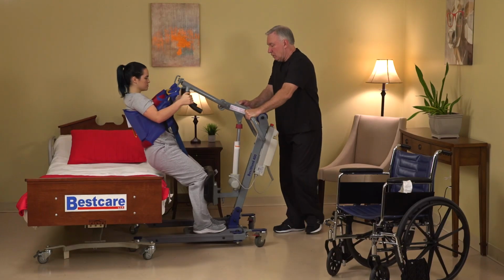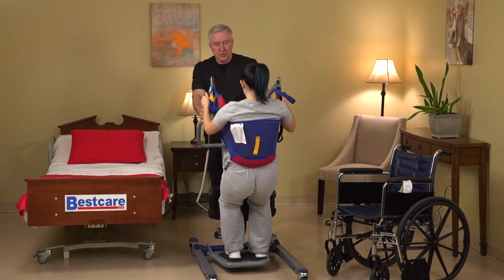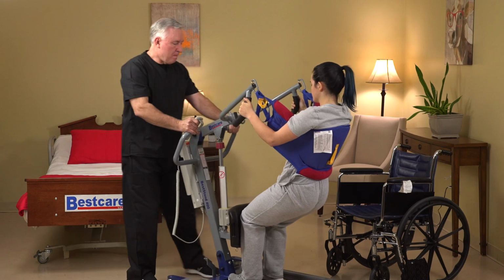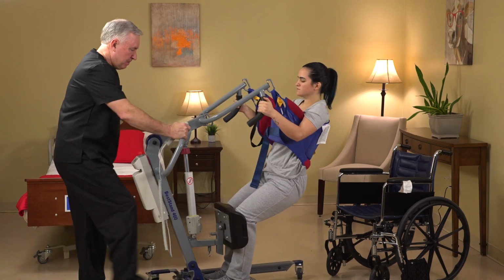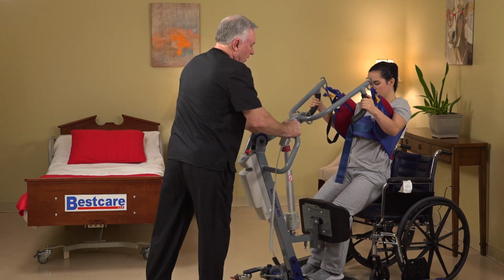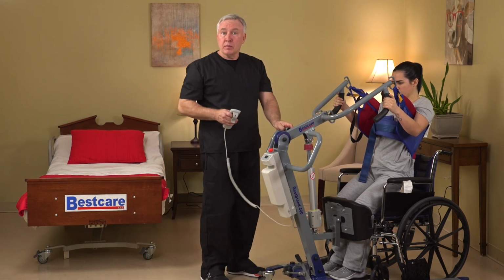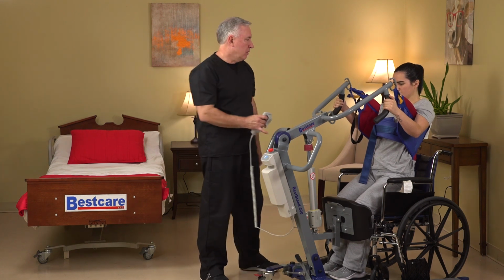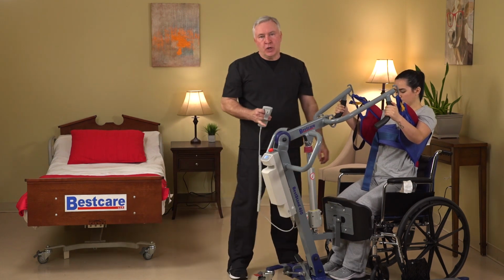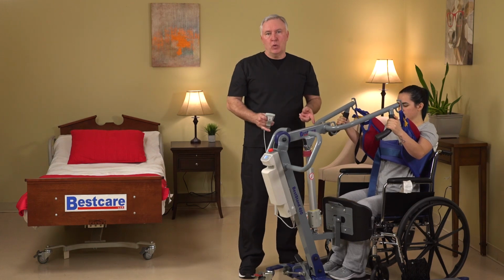Unlock the wheels. Position the patient towards the wheelchair. Open the base. Leave the wheels unlocked during the lowering position. And lower the patient into the wheelchair. Now you can see how to transfer the patient from the bed to the wheelchair with the BestStand.